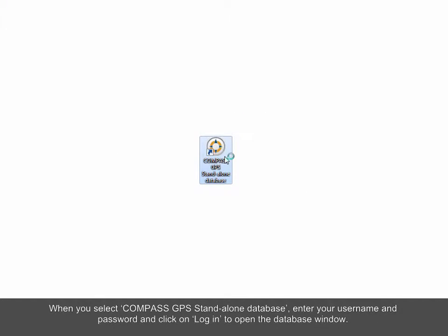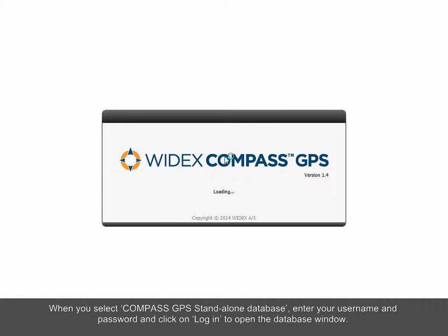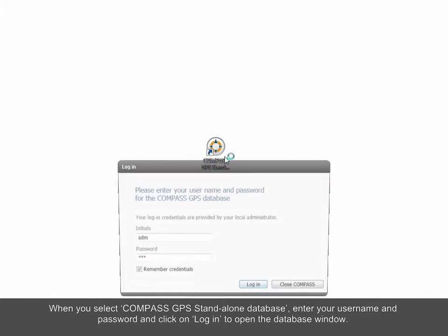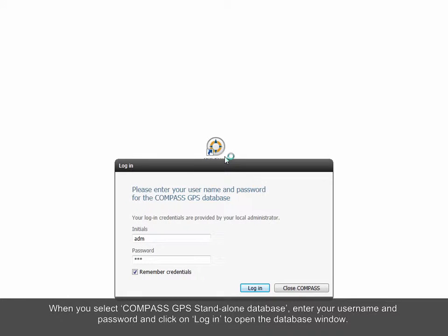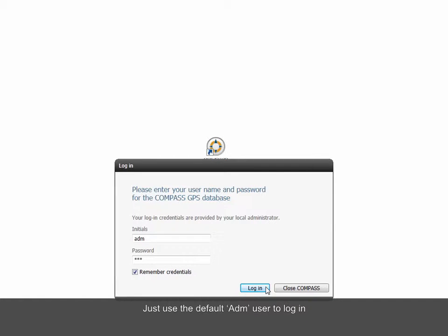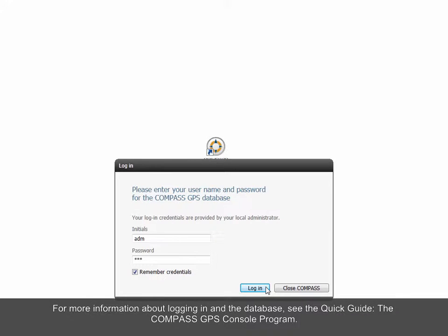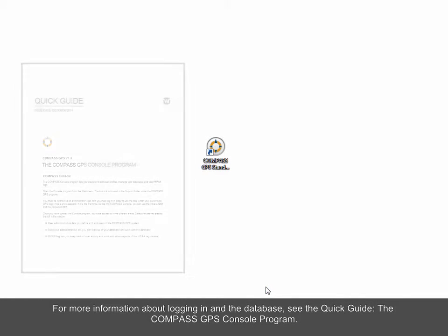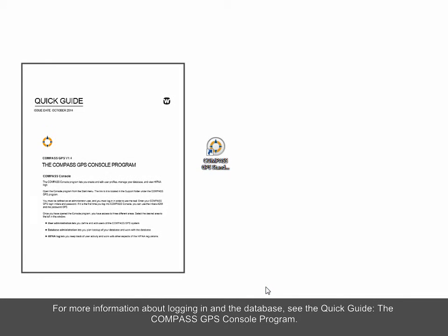When you select Compass GPS Standalone Database, enter your username and password and click on Login to open the database window. Just use the default admin user to log in. For more information about logging in and the database, see the Quick Guide, the Compass GPS Console Program.